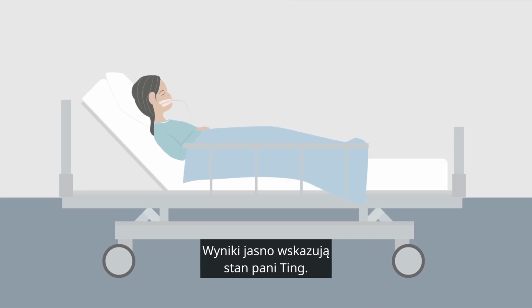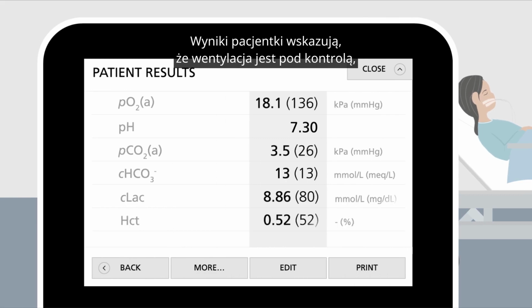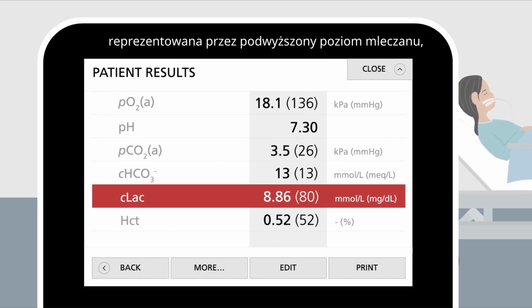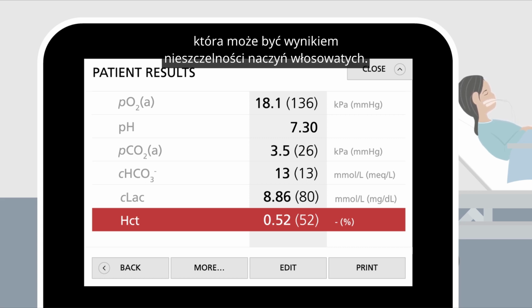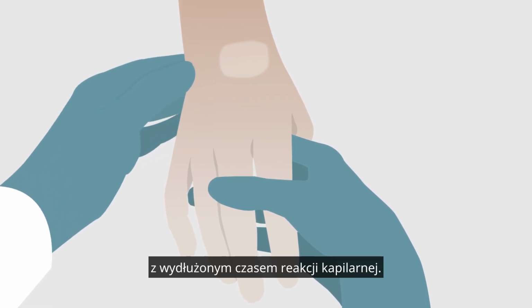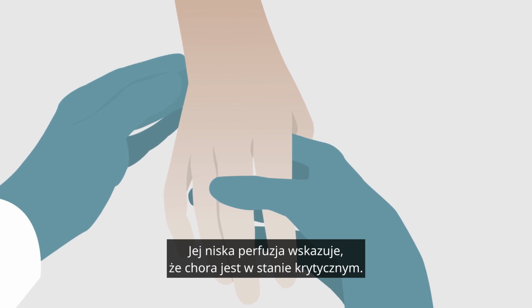The results give you a clear indication of Mrs. Ting's condition. The patient results show that the ventilation is under control, but there is still a circulatory instability represented by an elevated lactate level, and the hematocrit is elevated as a sign of hemoconcentration, which may be a result of a capillary leak. A new physical examination reveals that Mrs. Ting is still peripherally vasoconstricted, with prolonged capillary response time. Her low perfusion shows that she is in a critical state.